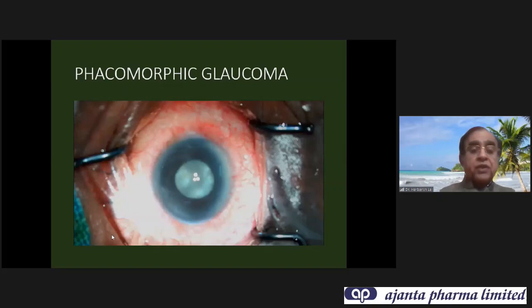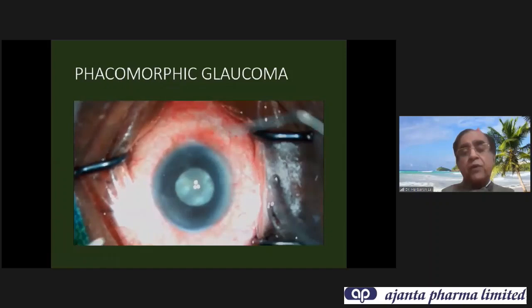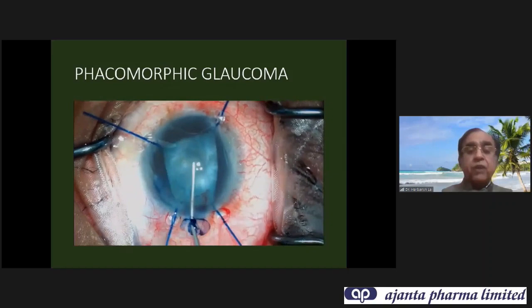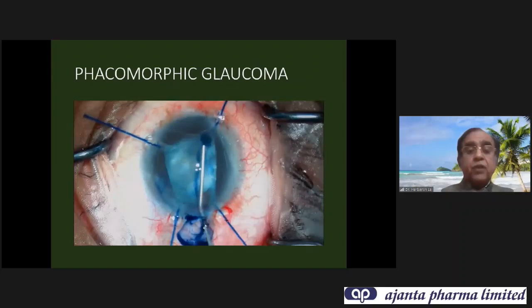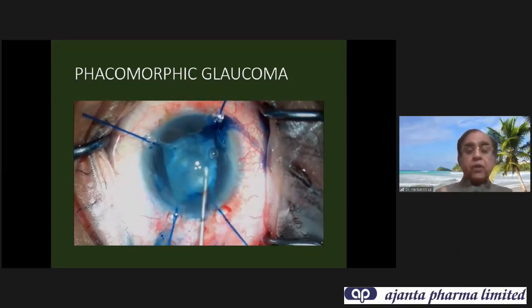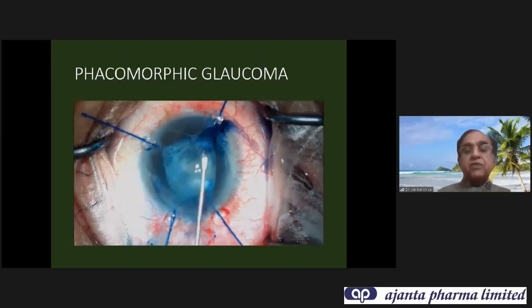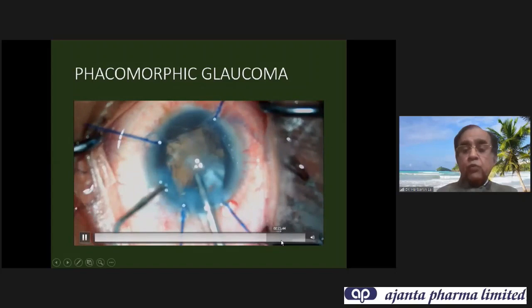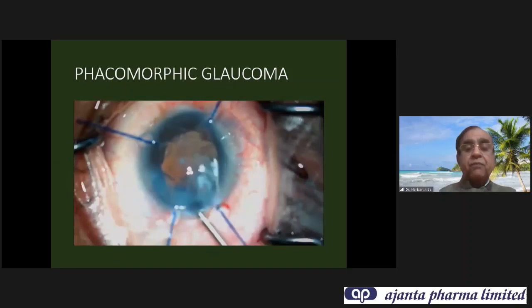In a case of phacomorphic glaucoma with pressure of 50 for the past week, we had no choice but to operate. We could barely put air inside, so we used hooks and viscoelastic, and stained underneath the viscoelastic. Hooks should be placed in a trapezoid shape, close to the incision and close to each other so no iris is left exposed. Even with a shallow chamber, corneal opacity, and a capsulorhexis margin tear, the phacoemulsification was performed successfully without any problem.